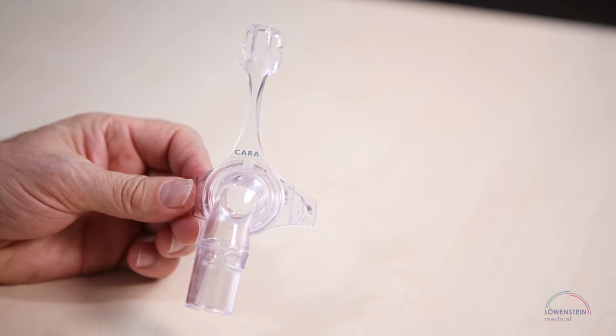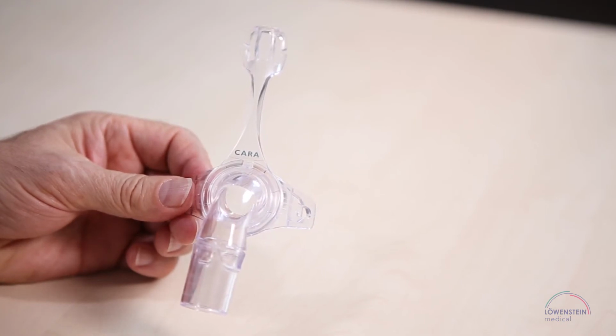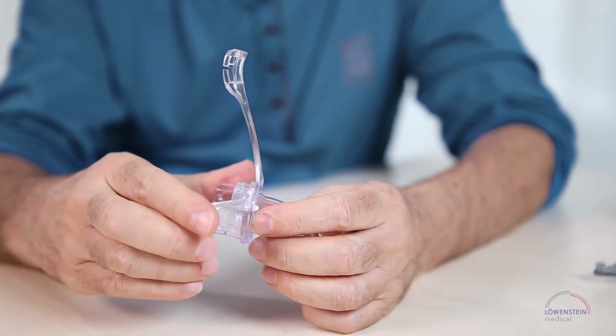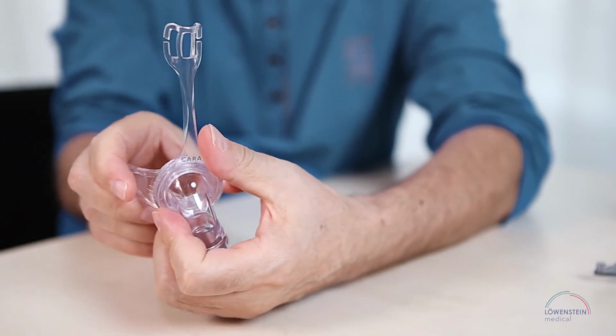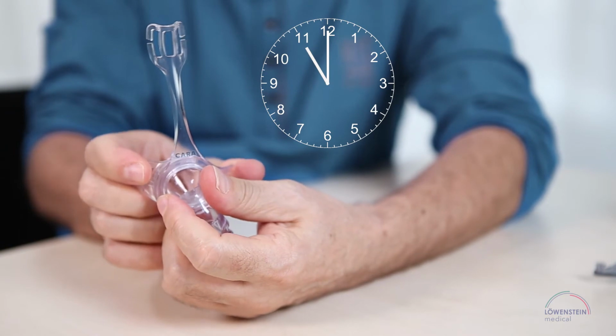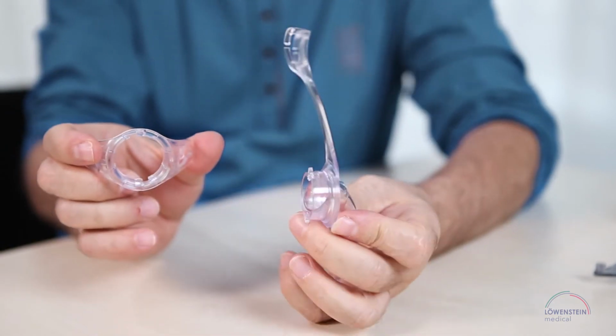The plastic parts of the forehead support can be separated easily to allow thorough cleaning. Hold the forehead support in one hand and the mask frame in the other. Rotate the forehead support from 12 o'clock to 11 o'clock and pull apart the two mask parts.